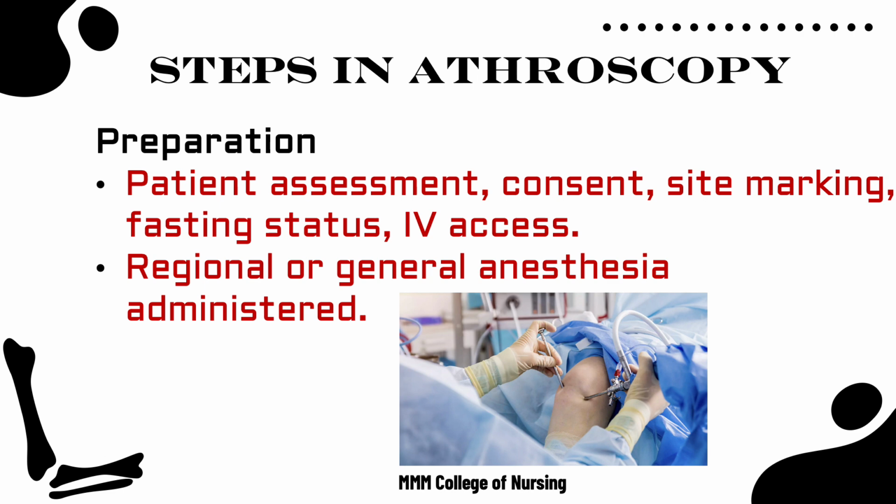In preparation, the nurse has to ensure proper patient assessment and that the consent is obtained. Site marking is done by the surgeon. Fasting status of the patient prior to the procedure is checked. IV access, ensuring the line is patent. Regional or general anesthesia can be administered to the patient after consultation with the anesthetist.